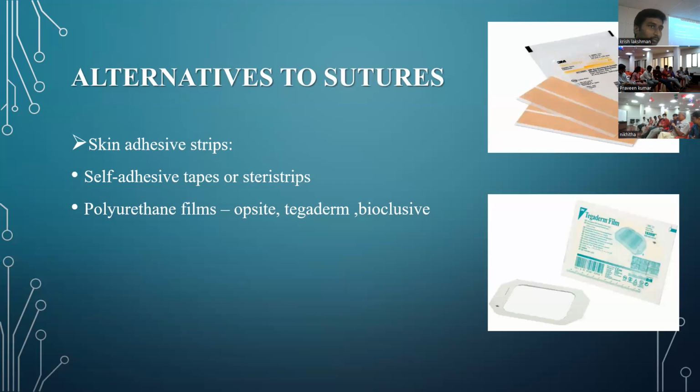And don't hold the suture with your forceps or with your instruments. That will weaken the suture by up to 60%. So never hold the suture with any of these, needle holder or artery forceps. They should be held only by hand. So this business of something giving way and the whole thing getting unraveled is not true.